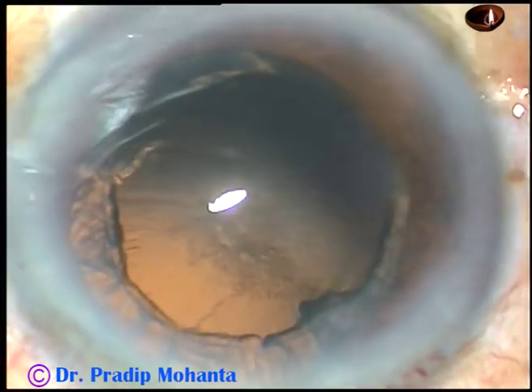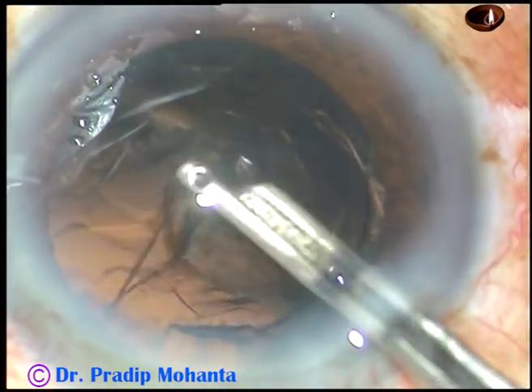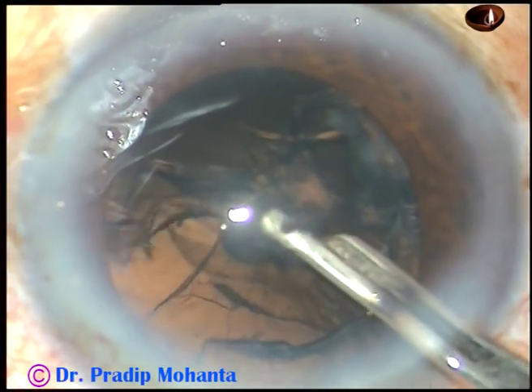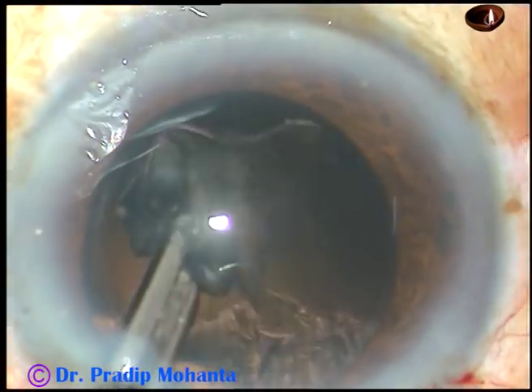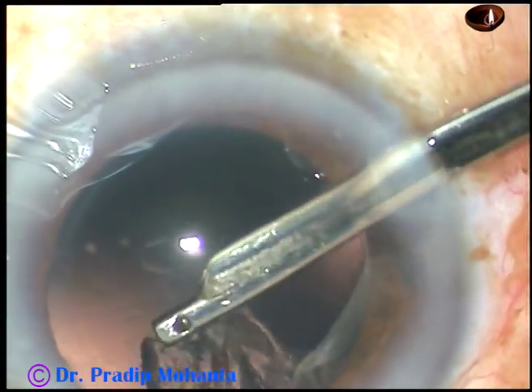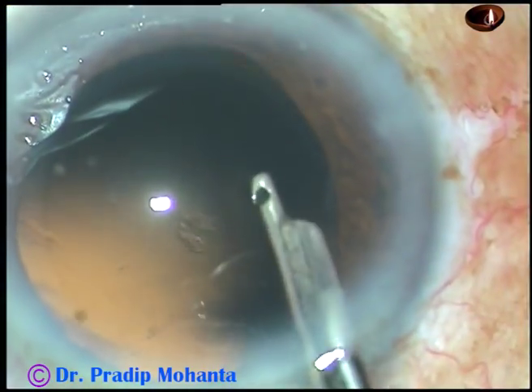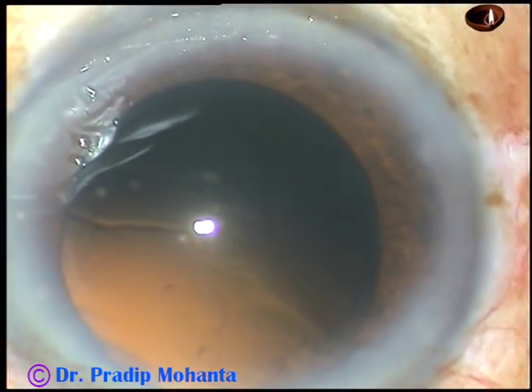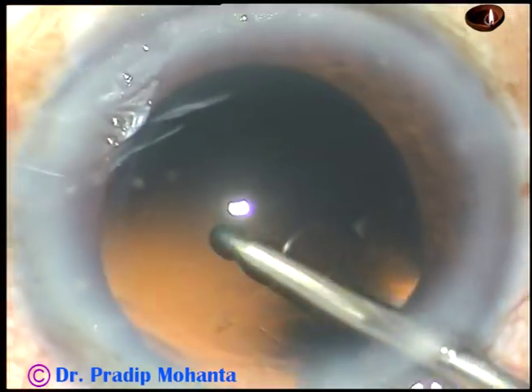I am going to use Simco. Simco is easier for beginners because you have done a lot of SICS where you have used this instrument. If you are a resident in the US or Europe, you can use bimanual irrigation-aspiration if you don't have this simpler instrument in your surgical trolley. Remove the cortical matter. You can see there is some cortex and some lens cells sticking to the posterior capsule — just polish the posterior capsule. You can use only the irrigating probe, only the fluid jet, to polish the posterior capsule.